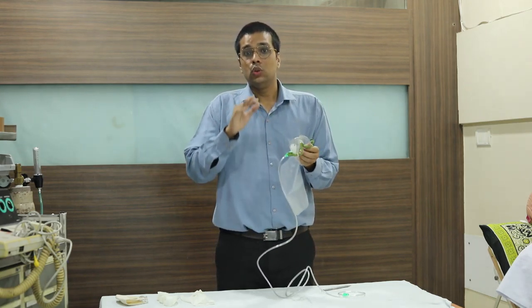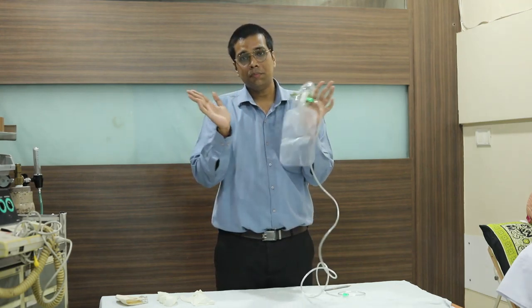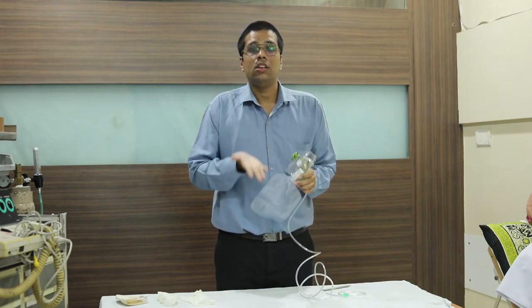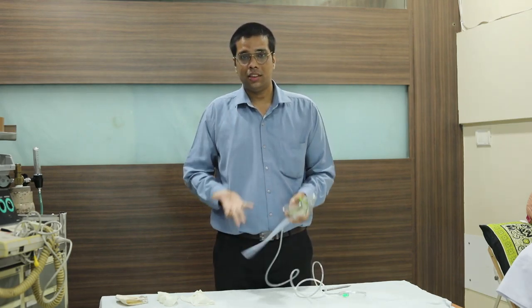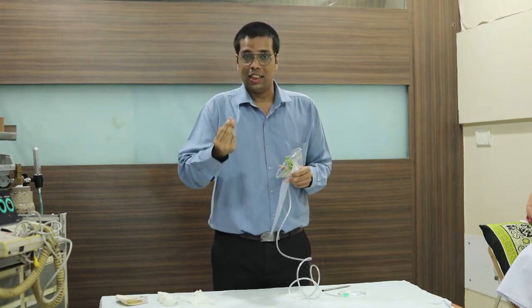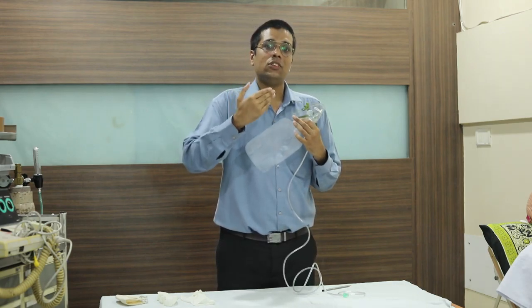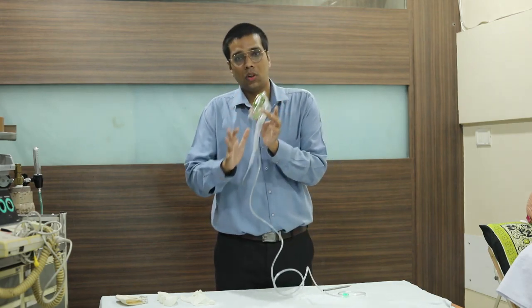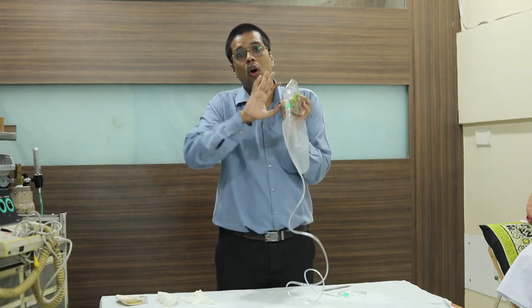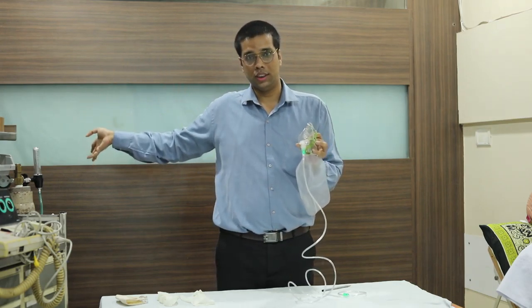There are three flaps in total. When the patient inhales, the exhalation port will close and the inhalation port will open, so the patient takes 100% oxygen. When the patient exhales, the patient's exhaled gas should not mix with the pure oxygen — so the exhalation port will open and all exhaled gases will move outside.